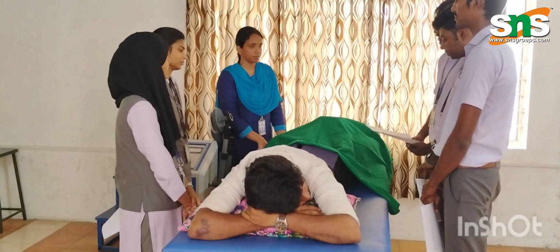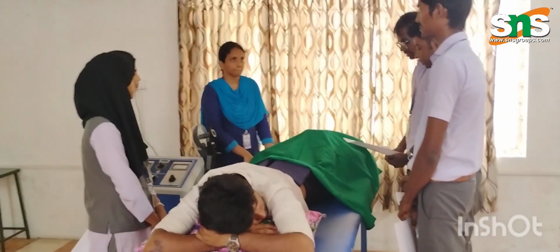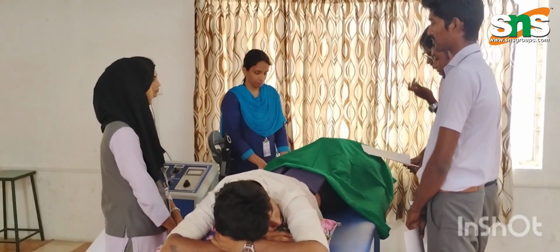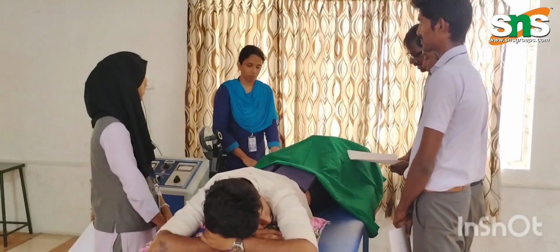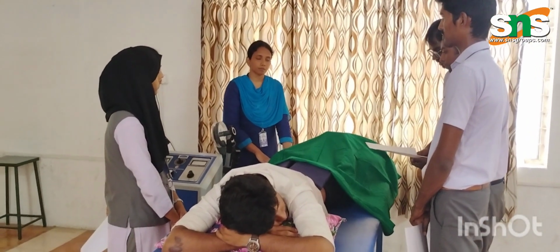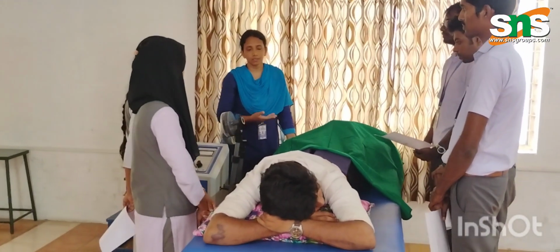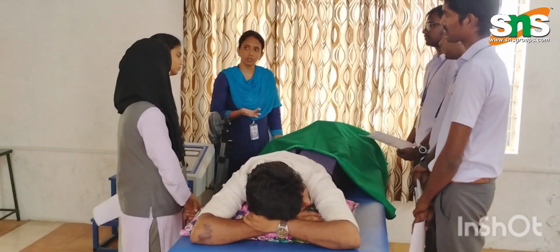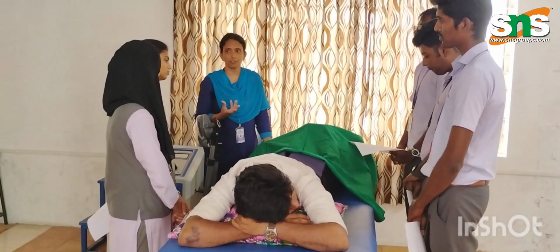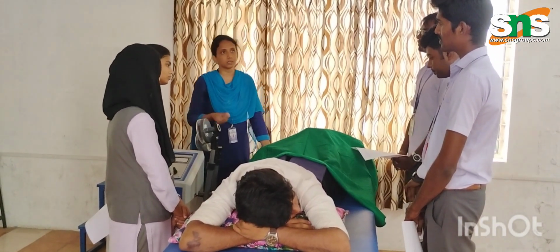Expected outcomes are pain reduction, increased range of motion, and better functionality. Short wave diathermy is a useful adjunct modality in chronic low back pain for pain relief and muscle relaxation, but active rehabilitation is the key for the long term. As he is an active office worker, he needs immediate pain relief. For that, we can use an electrotherapy modality to get a better result in pain reduction.